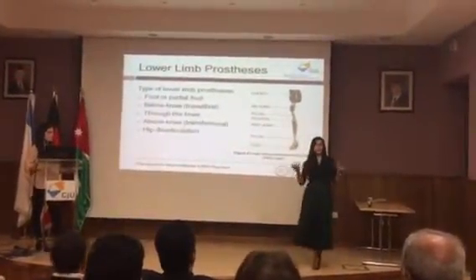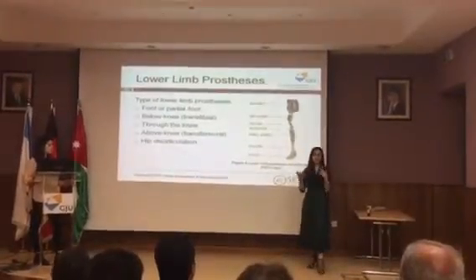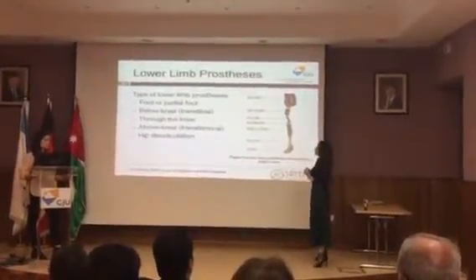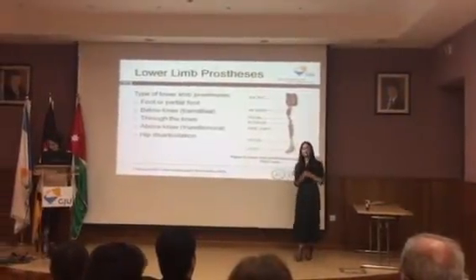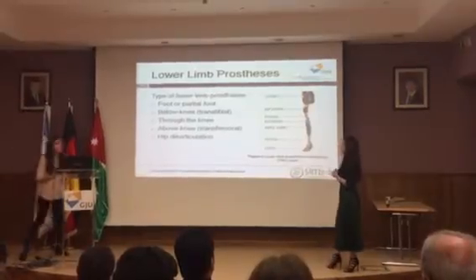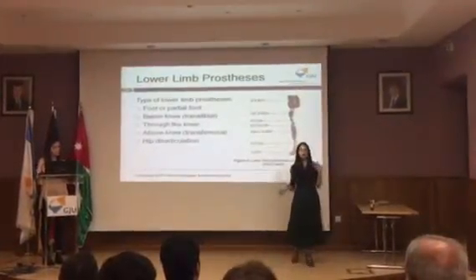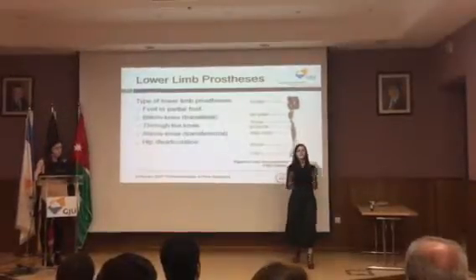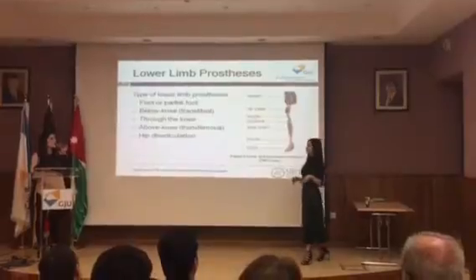A prosthetic is a device fitted to substitute for a lost limb. Due to the high focus on lower limb prostheses, especially in the medical sciences, there are various types of lower limb prostheses, which are fitted in accordance with a person's height, age, and level of activity, but most importantly, they are categorized according to the level of amputation.